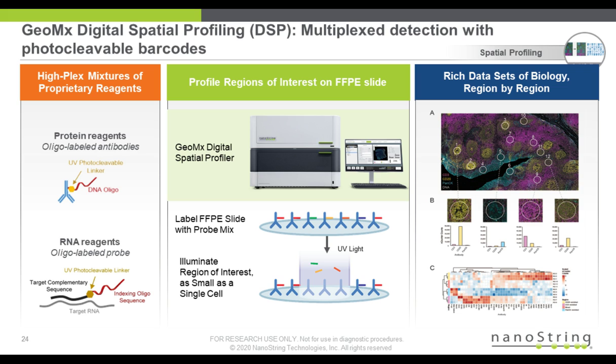The key trick behind how we did that was, instead of actually inserting all of our assays into the tissue and trying to deconvolve them with colors or whatever, I'm never going to do 10,000 things at a time and deconvolve it out of a microscope. So what we did is turn the entire thing backwards. You take your affinity reagents, you can see little antibodies over there on the left side of the screen, or your FISH probes, and actually instead of putting colors associated with them, you put a sequencing barcode.